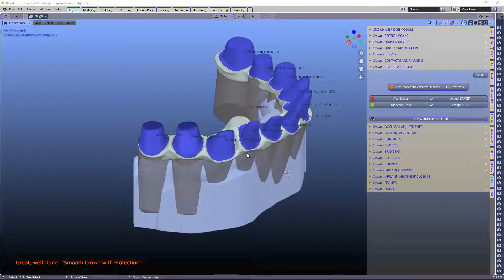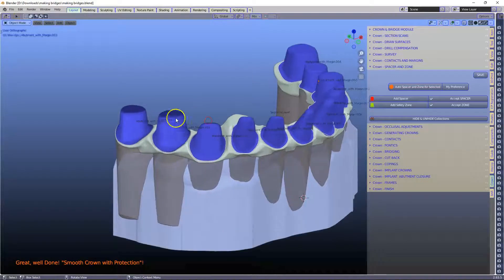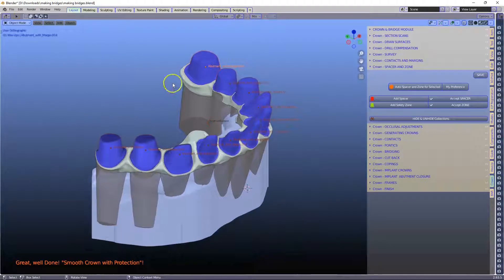Hey guys, I hope you are very well and thank you for sending me the file. Now this is a big job and we've had difficulty with making die spacer at thick spaces, say 0.35 or 0.4, so I have adjusted a few little scripts to accommodate this.